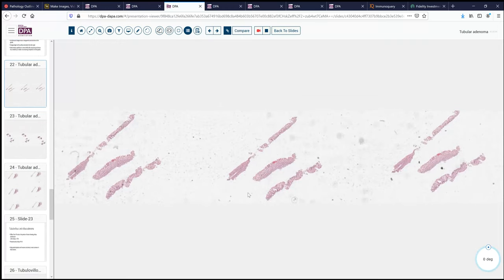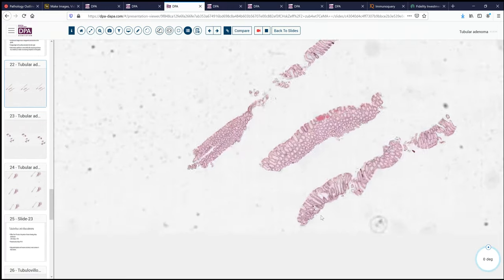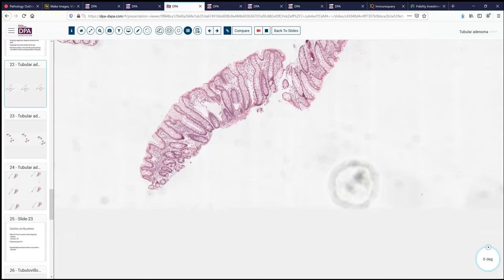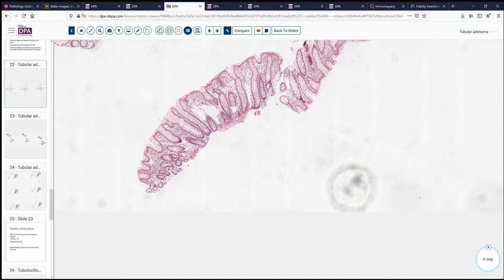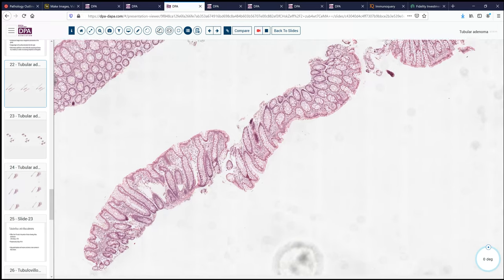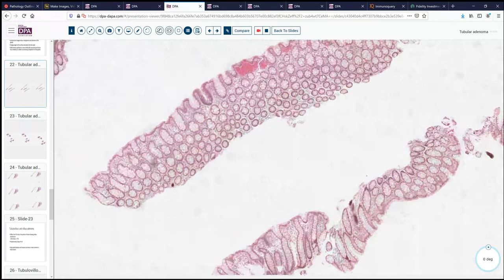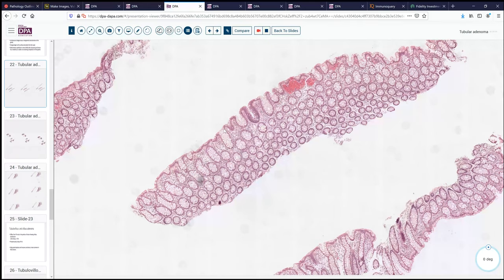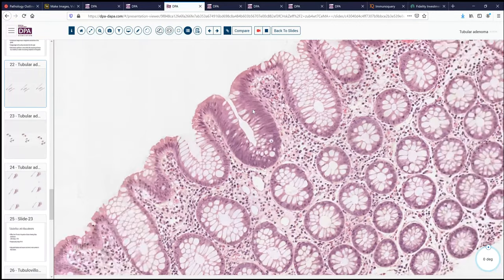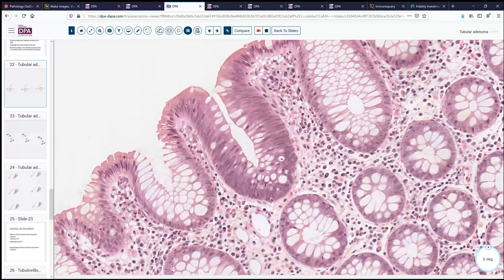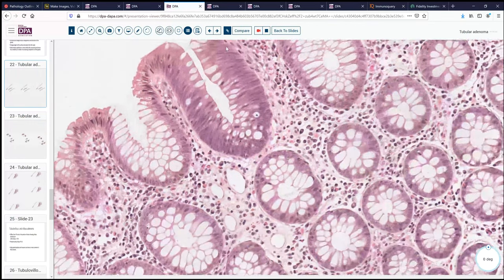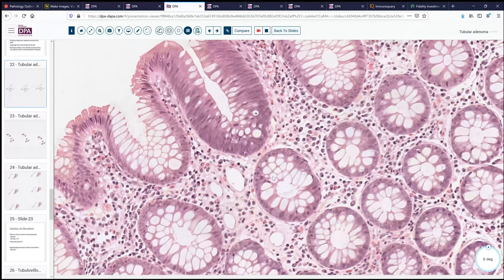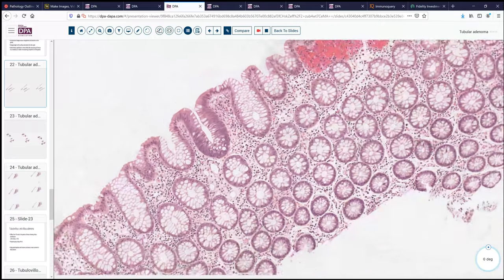Here's a section of colon biopsies. As we look at this, we see lots of normal glands. We can say we're not in the cecum or ascending colon — we've got a moderate number of cells, no Paneth cells. But looking a little bit more closely, right here, it just looks different. It's a little bluer, a little bit bigger. At higher magnification we see the nuclei are like little elongated cigars — they're crowded and cramped. This crypt, and maybe its extension down here, is involved by an early tubular adenoma or early dysplastic change.